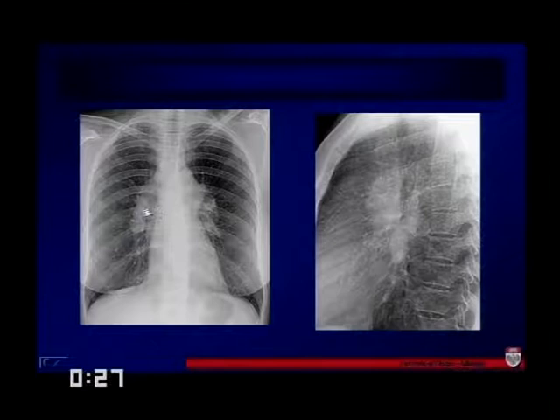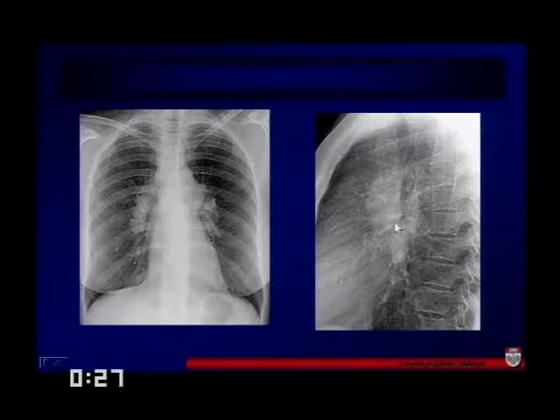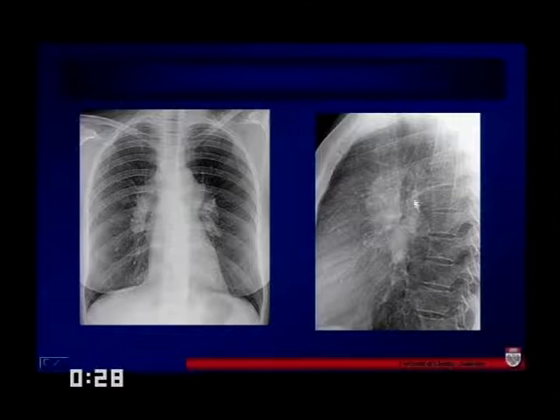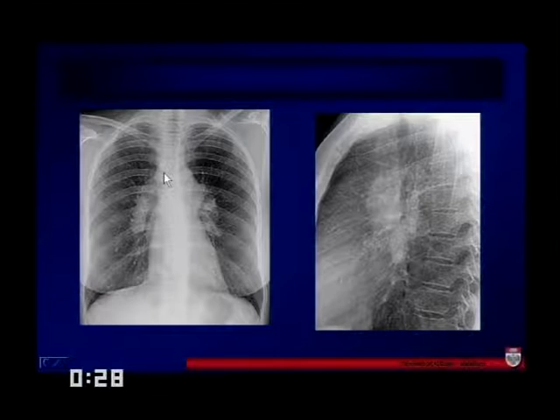This patient has bilateral hilar adenopathy — symmetric hilar adenopathy — which is almost synonymous with sarcoid. It's a good example of what hilar adenopathy looks like on the lateral view. This is the left upper lobe bronchus seen end-on, and below there's just too much soft tissue — adenopathy. We also have adenopathy posteriorly and significant adenopathy in the right peritracheal region. This is a good example of mediastinal and hilar adenopathy on chest radiograph, where being symmetric and bilateral tips us off that this is most likely sarcoidosis.